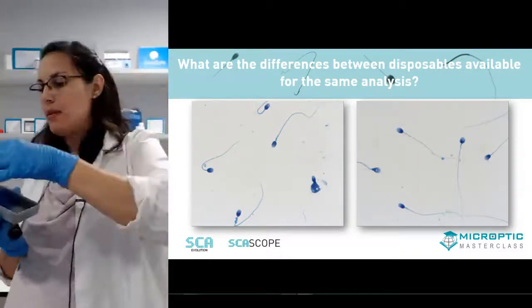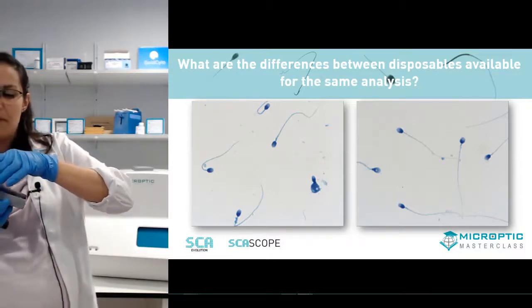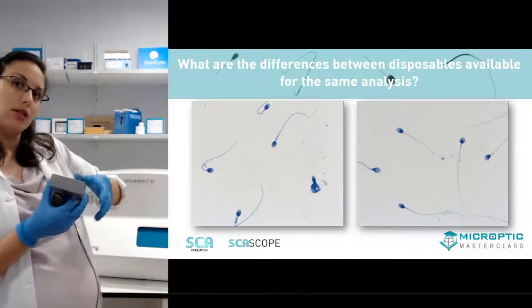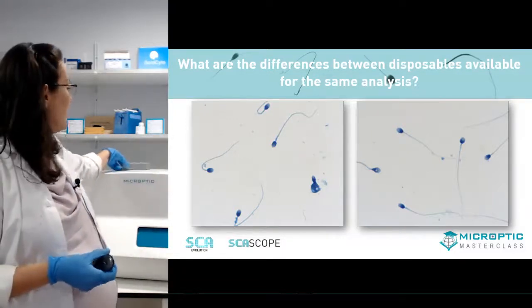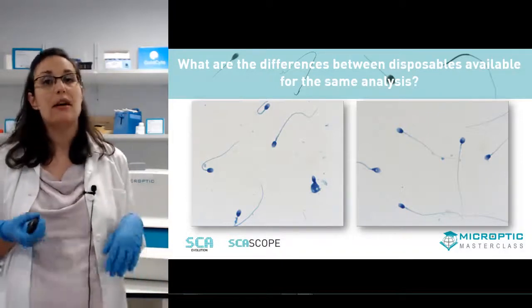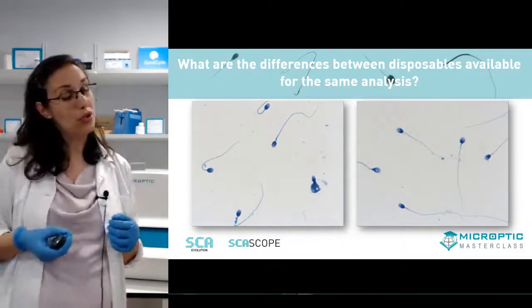Okay, that provides very good results after staining. And this is something very important to keep in mind, because in the market you will find a lot of pre-stained slides that don't provide the same accuracy as the liquid solutions.